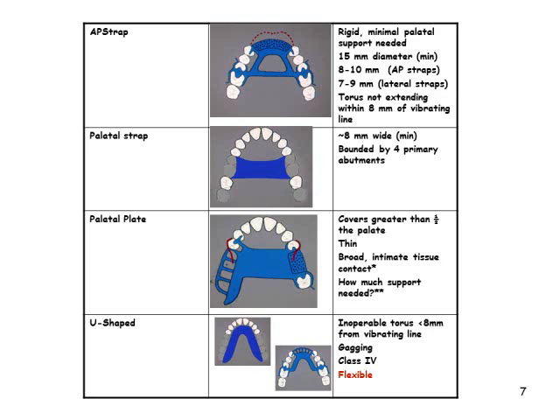The anterior-posterior palatal strap is used with Class I and II arches, in which excellent abutment and residual ridge support exists, and direct retention is adequate without the need for indirect retention.